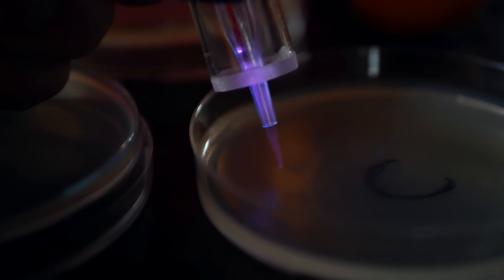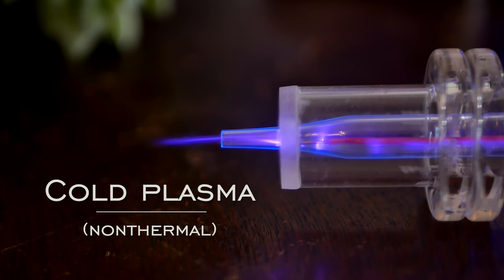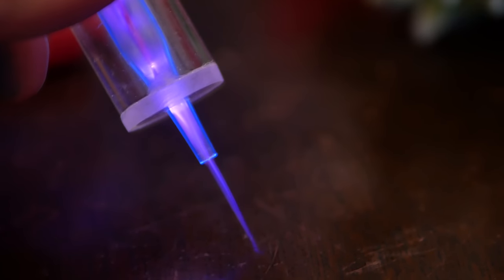It's straight up futuristic. Well, the research shows that's where cold plasmas, or non-thermal plasmas, come in. It offers an exotic solution for the everyday problem of cleanliness. So I've built a cold plasma wand, and I think you'll be shocked by what it can do. Let's go.